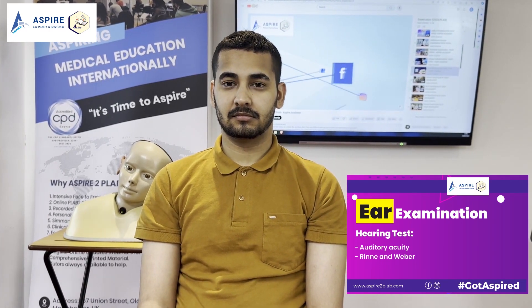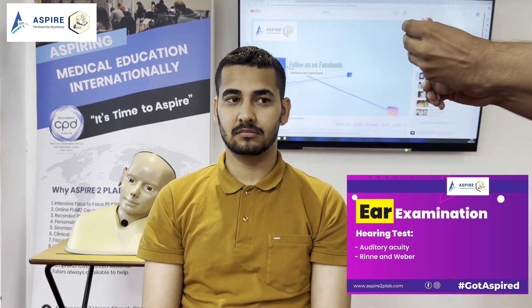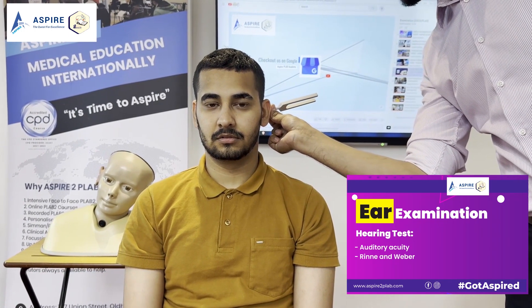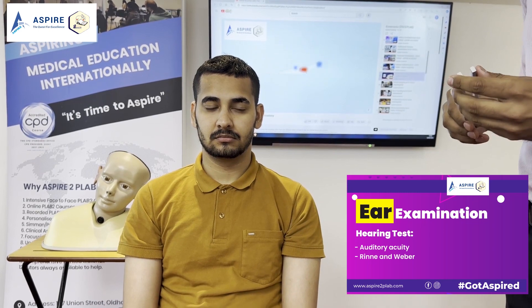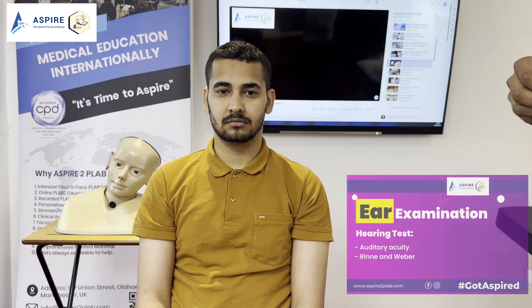Let's do it on the other side as well. Tell me if you can hear it. Can you hear? Yes. Tell me when it stops. Stop. Can you still hear? Yes. So it means it's the same on the other side as well — air conduction is more than bone conduction, meaning Rinne positive. So my patient is either normal or might have sensorineural hearing loss. That I'm going to confirm by doing Weber's test.